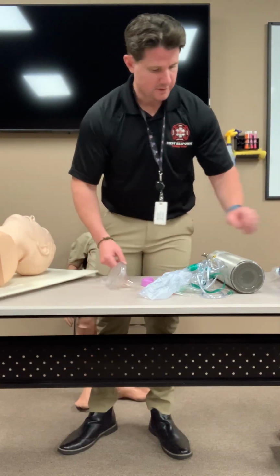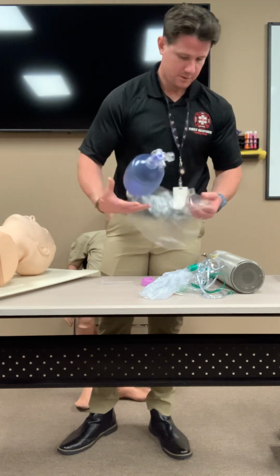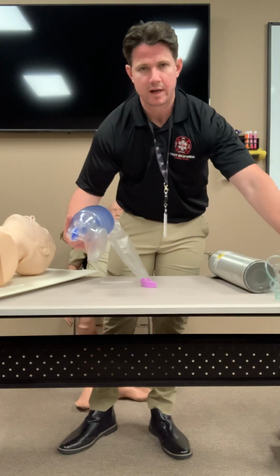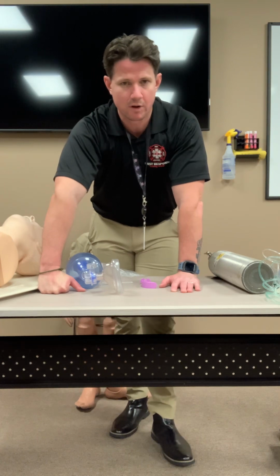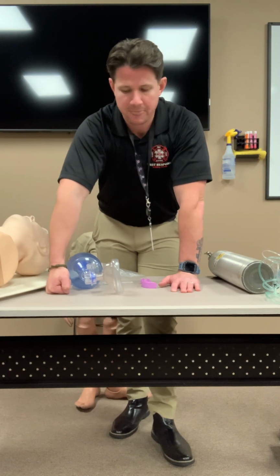Next, we'll do the BVM, okay? Now, this particular BVM doesn't have oxygen tubing, but again, I will verbalize it, all right? Part of this is knowing exactly what you need to do. If you know what right is, then you can see what wrong is. So you just verbalize what is appropriate, right?